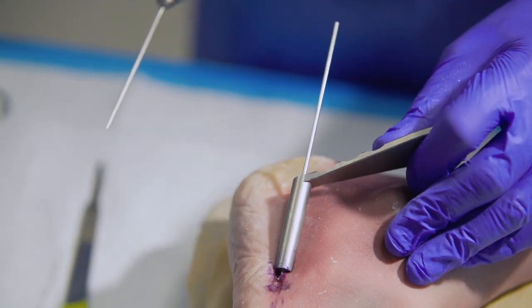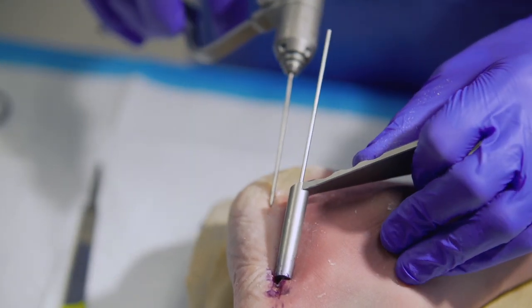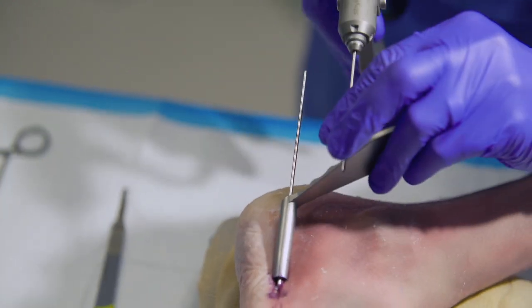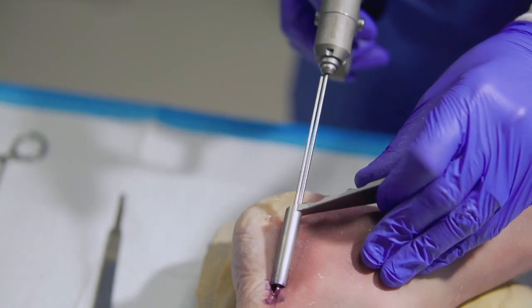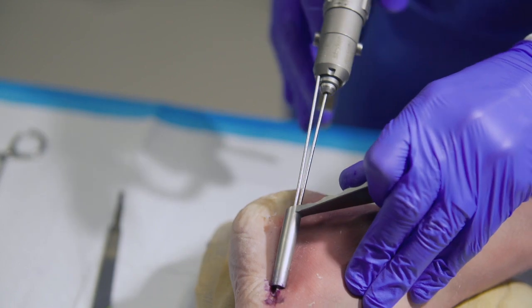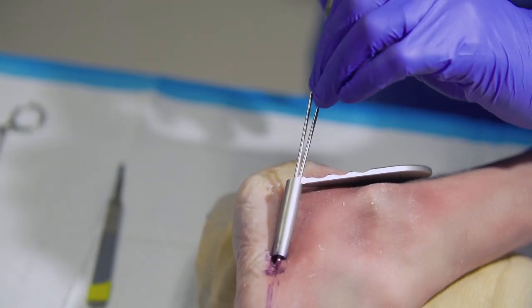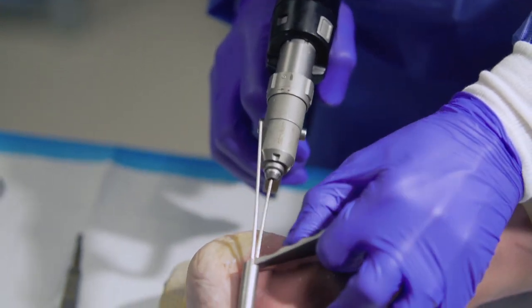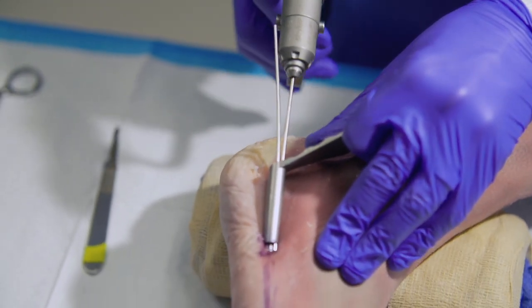So now we've placed the parallel positioning guide utilizing the middle slot. And we'll take a second wire and use the opening just superior to get our ideal positioning.